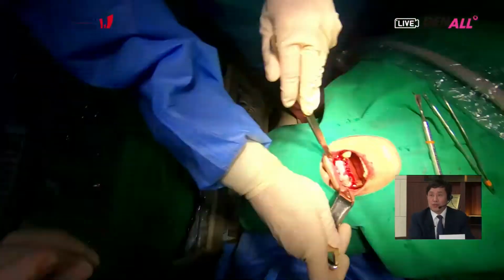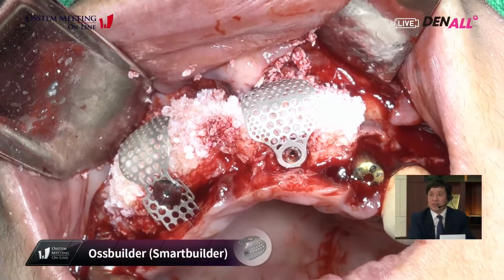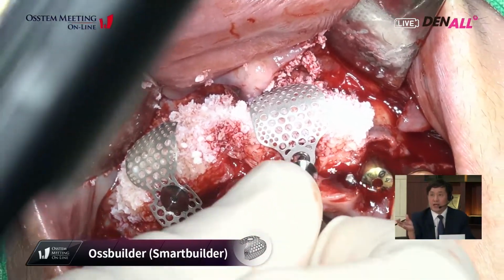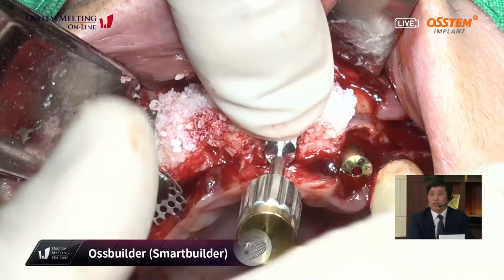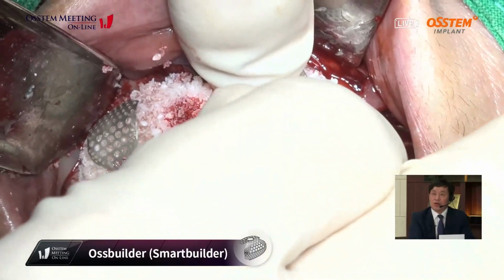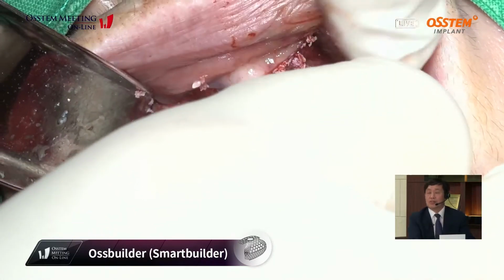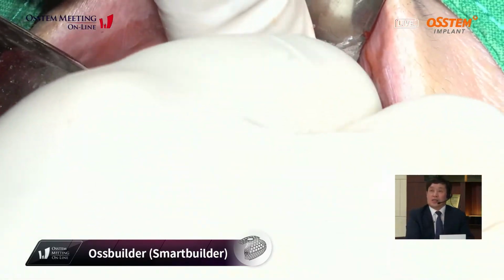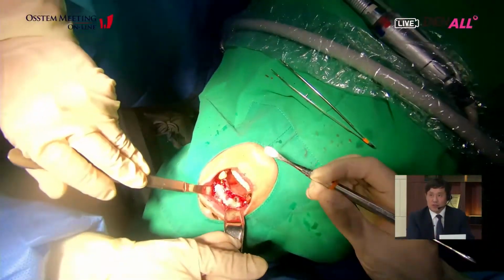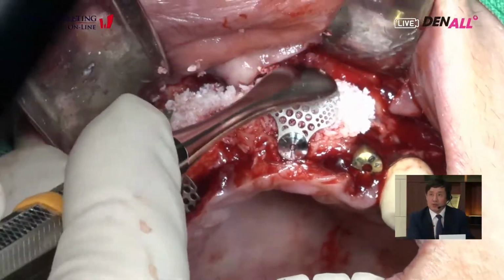Application of another Ossbuilder to the number 21 side of the implant. This implant has no wing on the palatal area. This is only augmentation of the labial side. And he can apply the cover cap for fixation of the Ossbuilder in the appropriate position. Usually you can fix it with the cover cap while holding the appropriate position of the Ossbuilder.